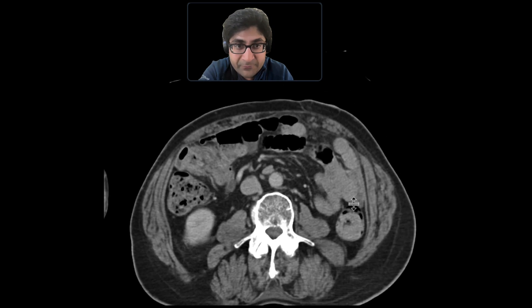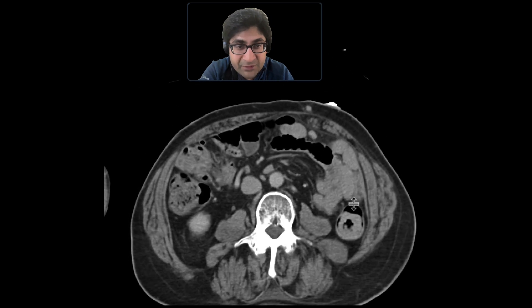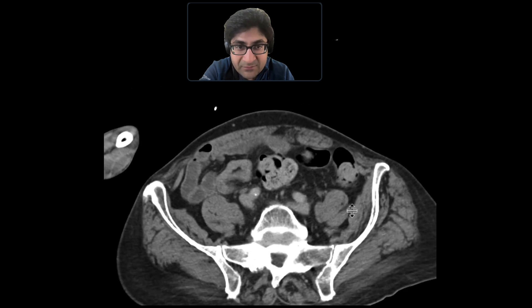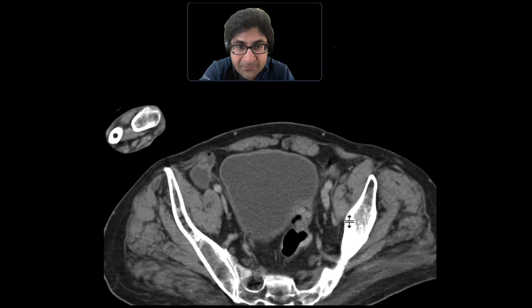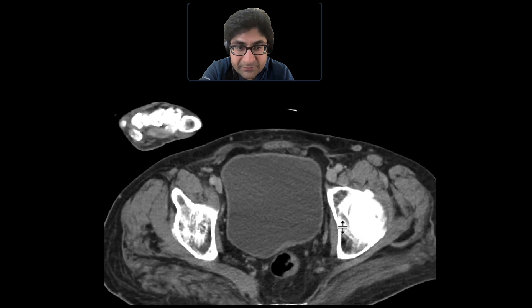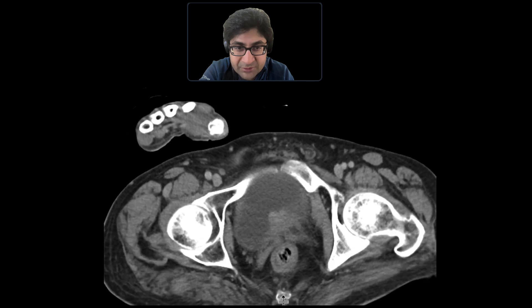As we scroll more inferiorly, there's going to be a bunch of other nodules — one here, one in the subcutaneous fat, and perhaps also even more inferiorly down in the pelvis with a bunch of nodules there.